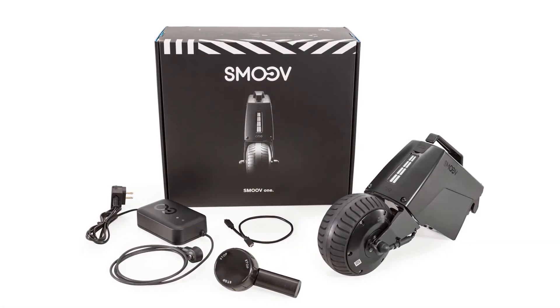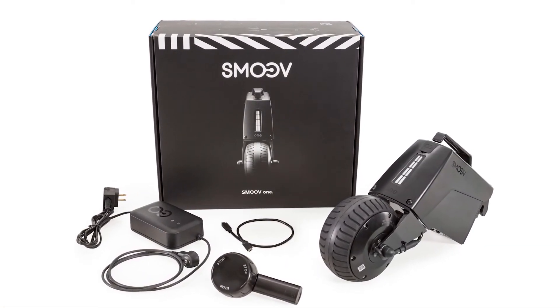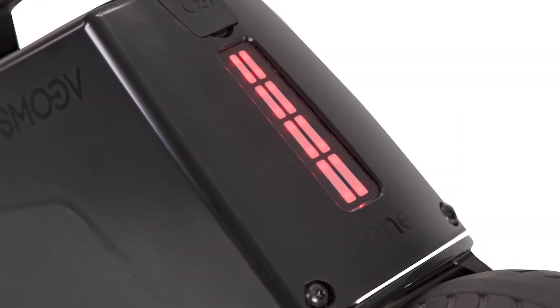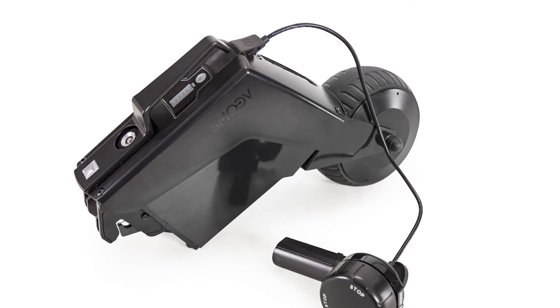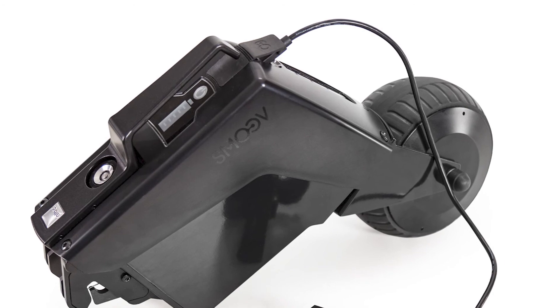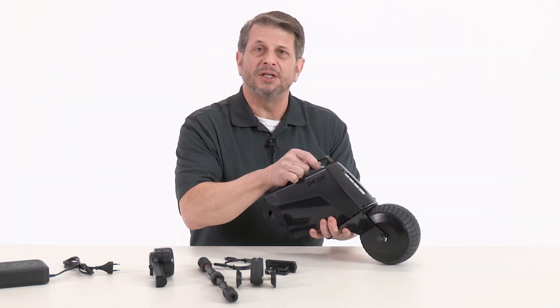A couple more cool things before I show you how to attach a SMOOV One to your chair. It's got a position light to help people see you any time of the day or night. It has a USB-C connection, which means you can charge the control unit, your cell phone, or any other small electronic device. Okay, let's put this on the chair.